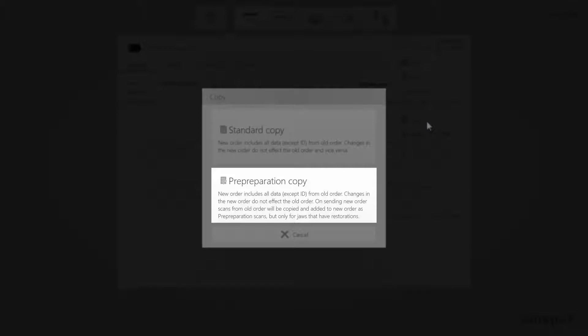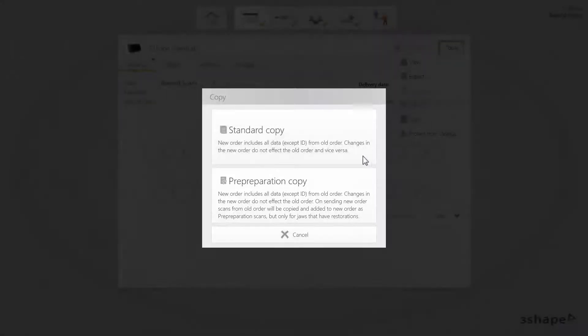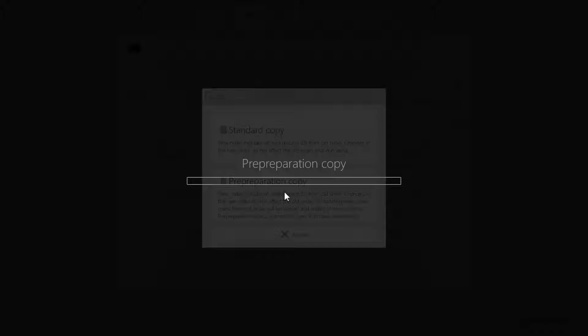In this case, however, while sending the new order, the scans from the old one will be added as pre-preparation scans. Select the pre-preparation copy. The scans are now copied.